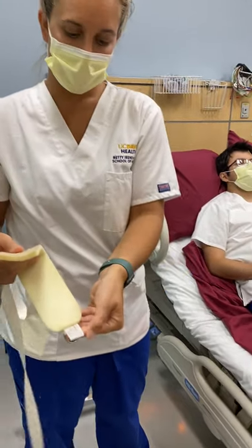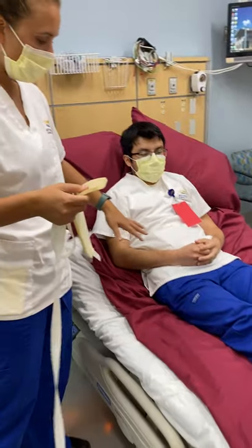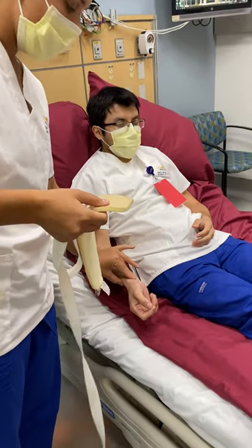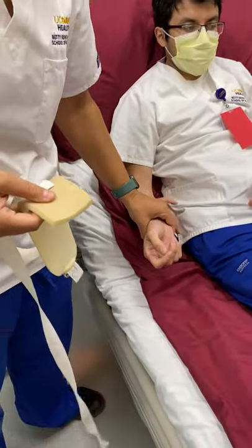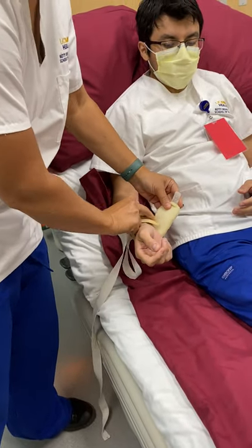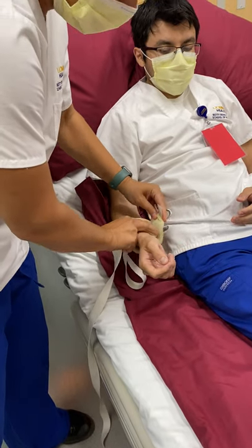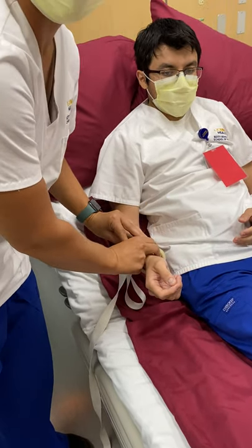You'll see that it's going to be placed on like that. So always assess the site — always make sure that you check your pulse and check your circulation. That's really important because if you have a bounding pulse now and then you put it on and you have a weak pulse later, that means that you put the restraint on too tight.